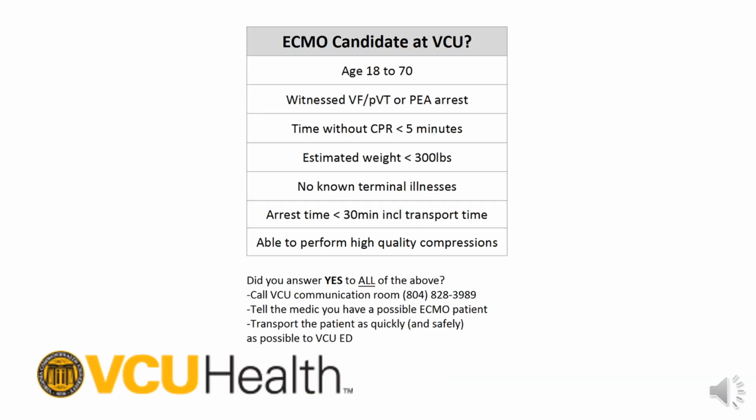And the nice thing about this is that if the answer to all of these questions is yes, you're good to go. Okay, so that's probably what you're going to need to say if you call into VCU. We've listed our comm room number here. Tell the medic you've got a possible ECMO patient, and then move as quickly and safely as you can to the ED at VCU.